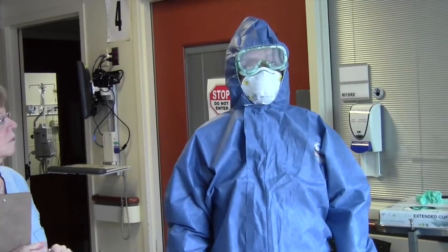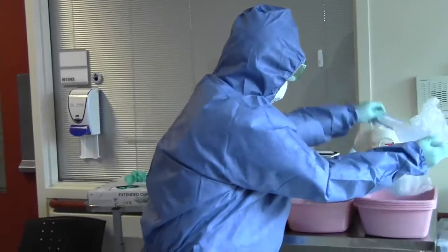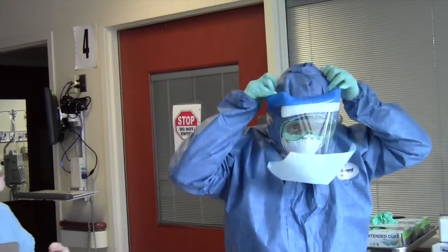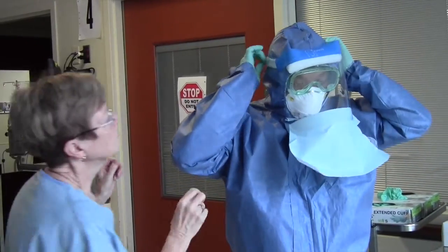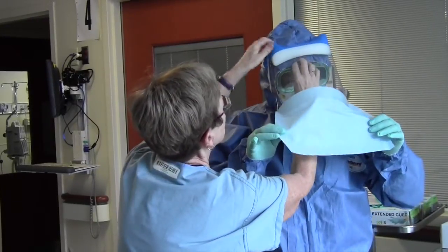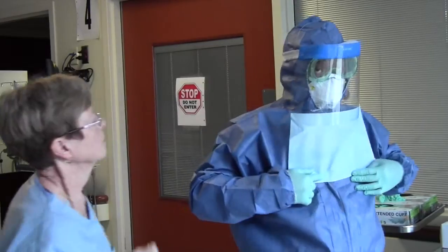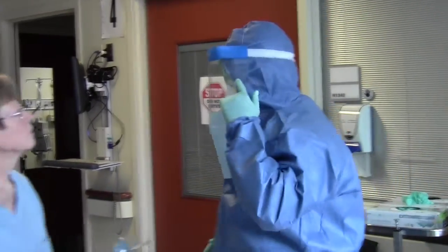Step 10. Put on full face shield. The face shield worn has flaps on the sides to provide better coverage. As it's difficult to see for yourself, the observer will ensure that you have as much coverage as possible.